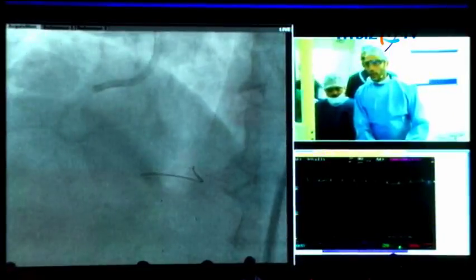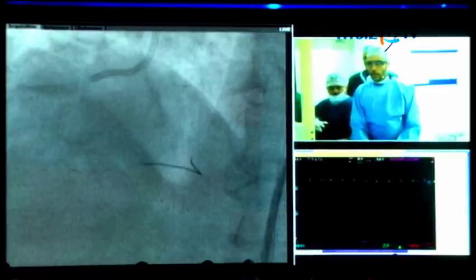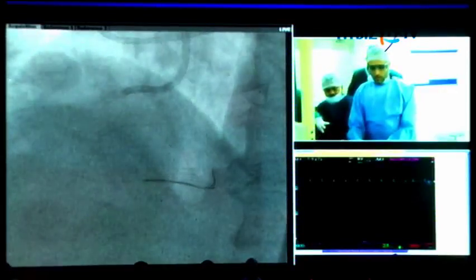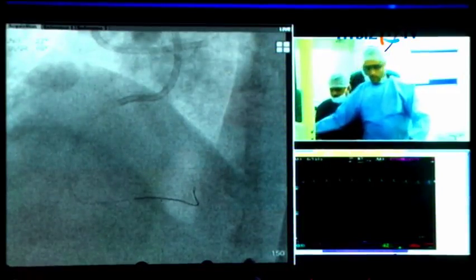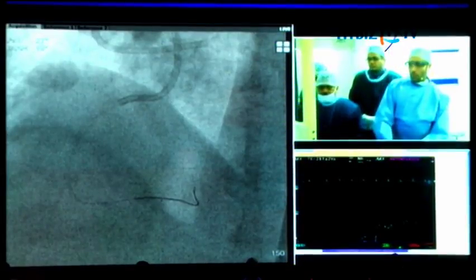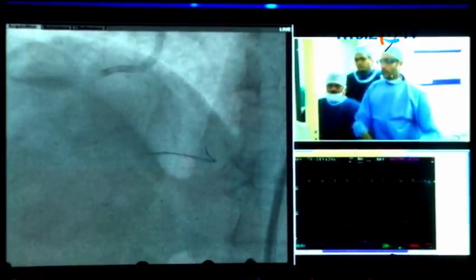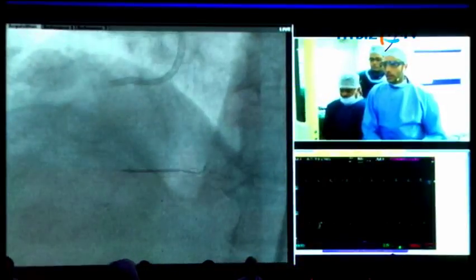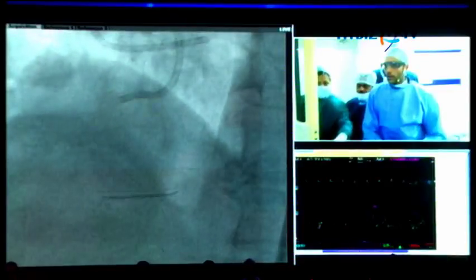The problem with stopping and coming back after 8 weeks is, do you stop only when you fail, or do you know before that? At what point do you stop? If he finds it's subintimal now, then he stops. If you find it subintimal with balloon dilatation, he advised that it's better to stop and do a re-intervention. Do you try re-entry or abandon? Because Galassi, after 2 to 3 months, you do a re-entry from the subintima to the intima.